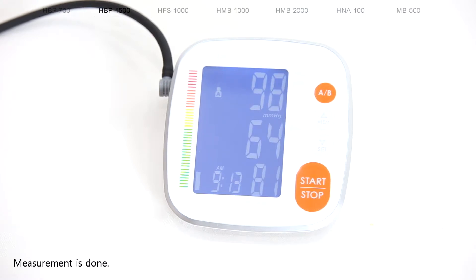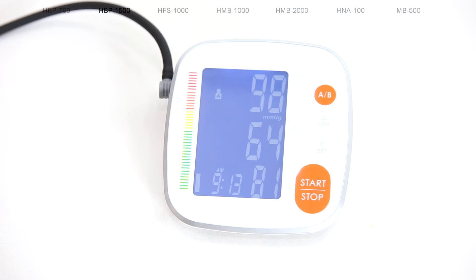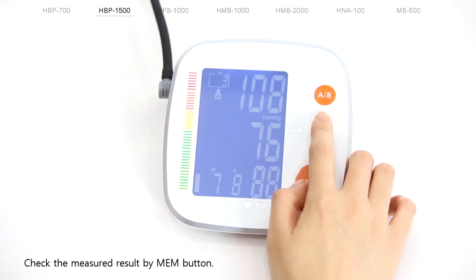Measurement is done. Check the measured result by the MEM button.